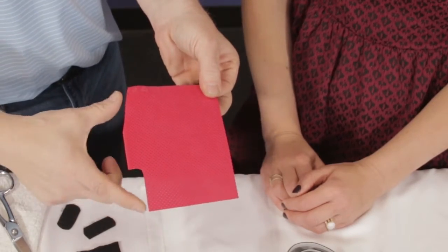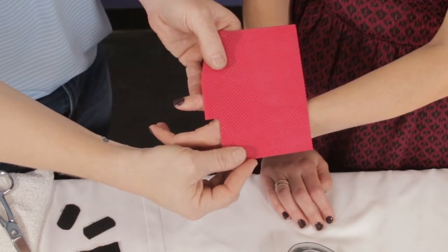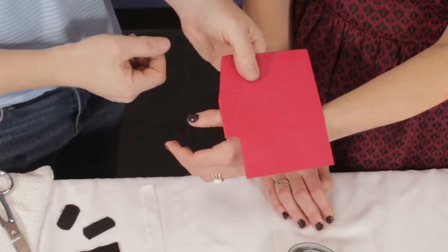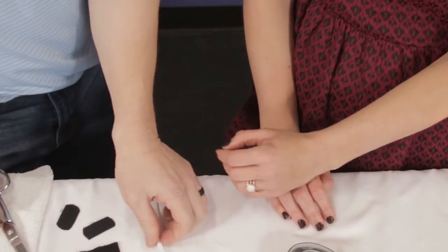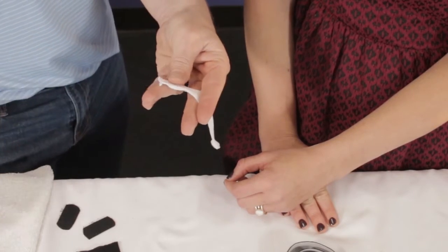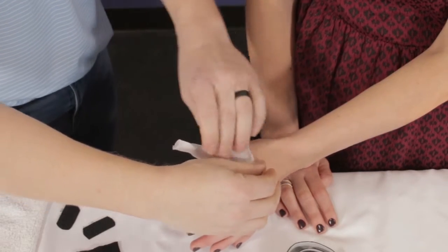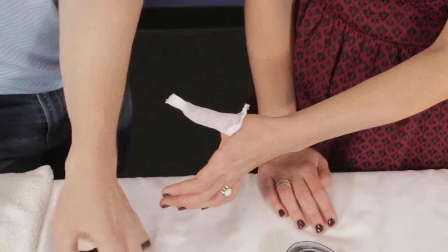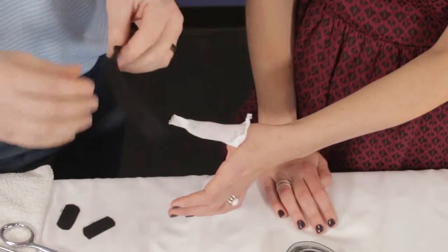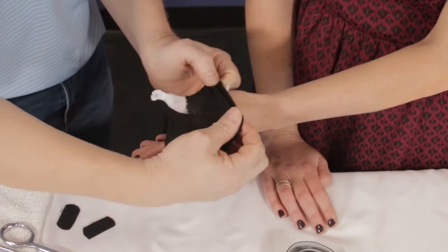For our first version — the one where we cut thirds off of either end — I'm going to orient this on her hand so that the notch goes along the back, with that edge right at the IP of her thumb. The little cut-off will wrap around the palm side. I'm going to take one-inch stockinette, cut a little slit in it to help get it on her web space, and slide that on nice and gentle. Then I'll take two-inch stockinette — we use this so it's a little more comfortable for heat-sensitive patients. Whole hand goes in, thumb goes in the extra hole.